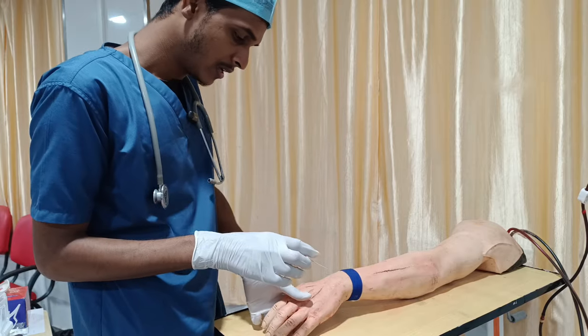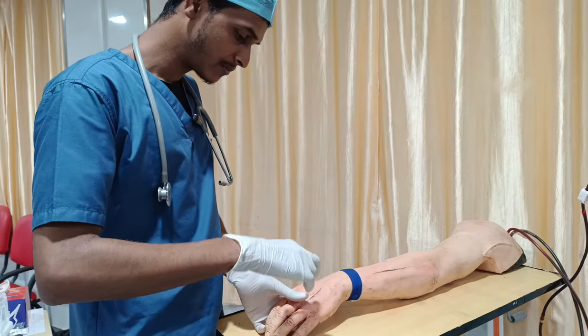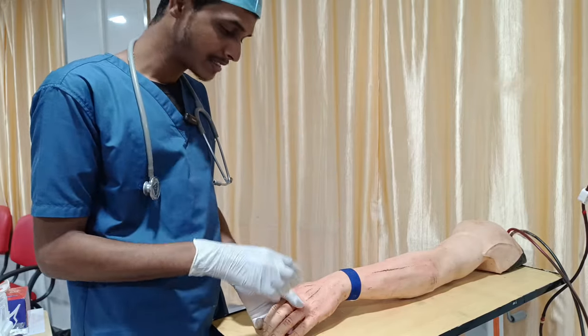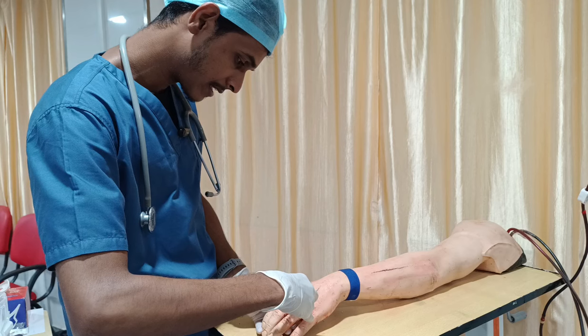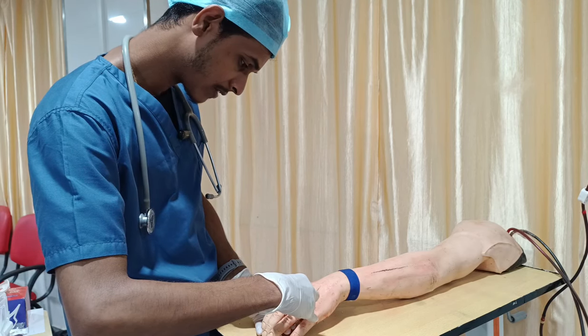The lateral pressure tightens the skin, which is helpful especially in elderly patients whose turgor is somewhat less. So I give lateral pressure and then insert here, at about a 30 to 45 degree angle.